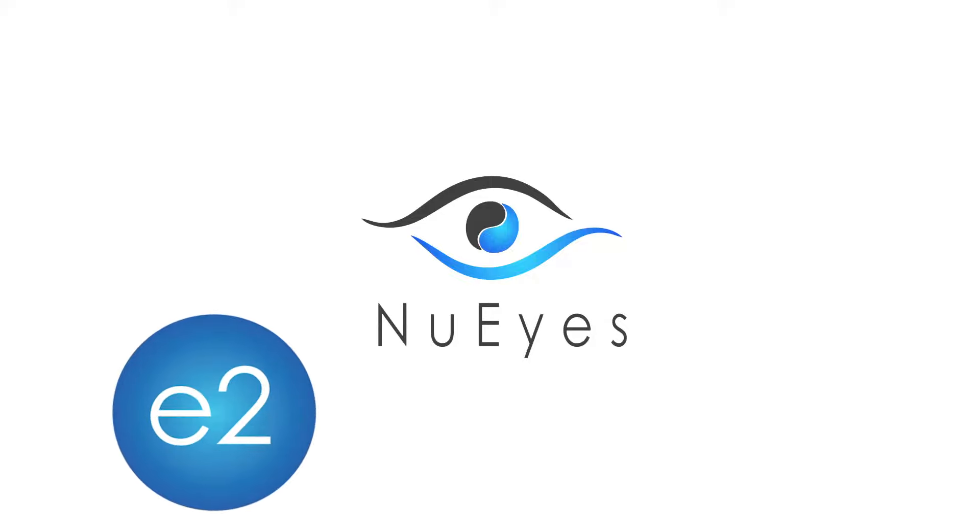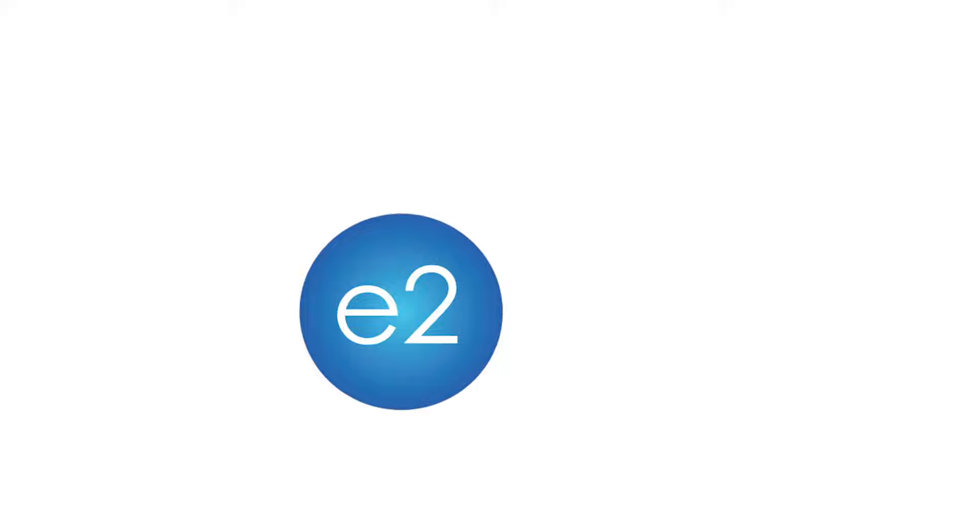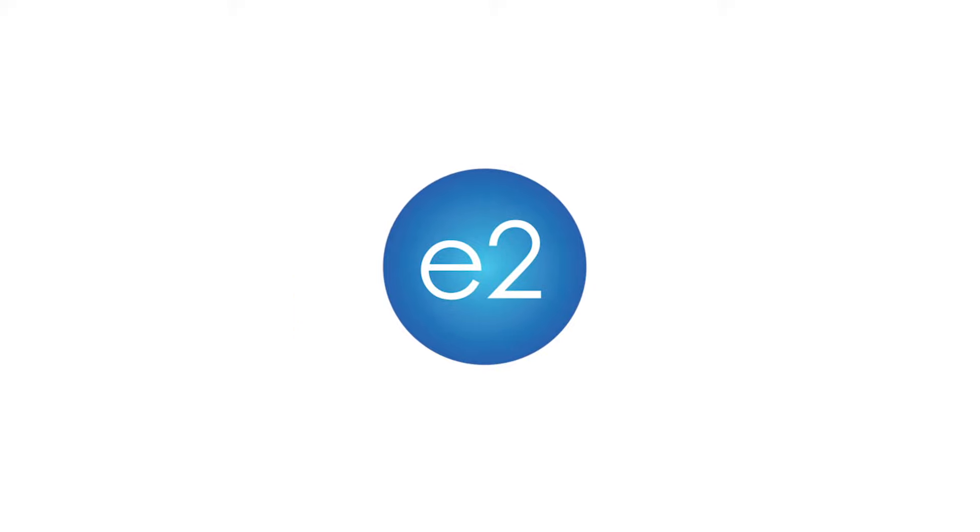Welcome to the NuEyes E2. In this short video we'll cover the operation of the E2 and its functions.